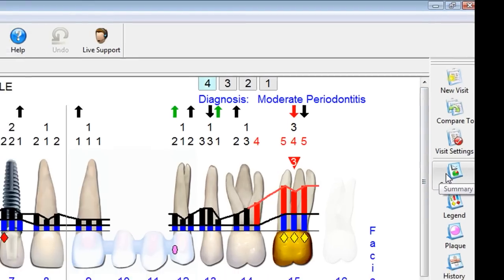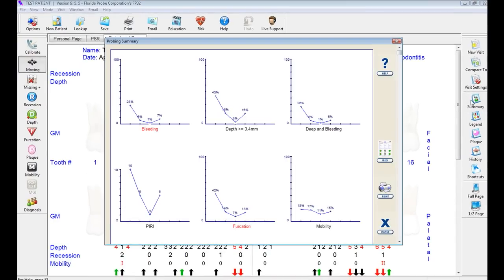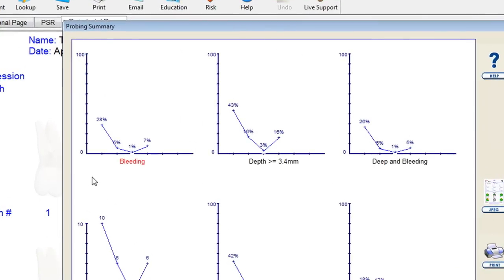Let's take a closer look at the summary information. Here's a patient that's been in four different times. With this much data on screen, it's nice to summarize it into a bite-size understanding of what's happening. 28% of their sites were bleeding on their initial visit. After treatment, they came down to 5%, responding really well. They continued to respond well at the next visit, but some time has passed since then and they've started to trend in the wrong direction — it's going to be time for another round of treatment.